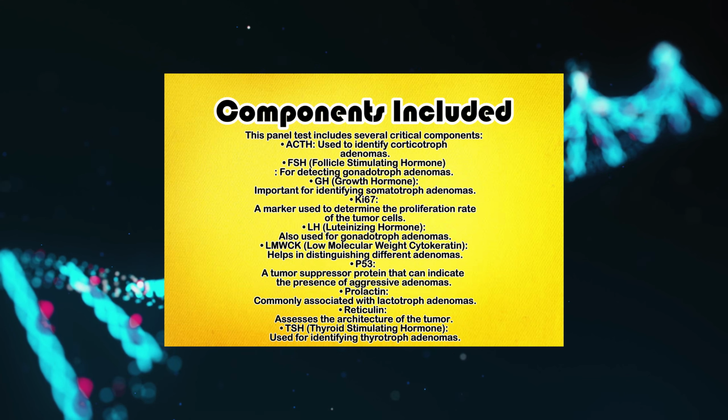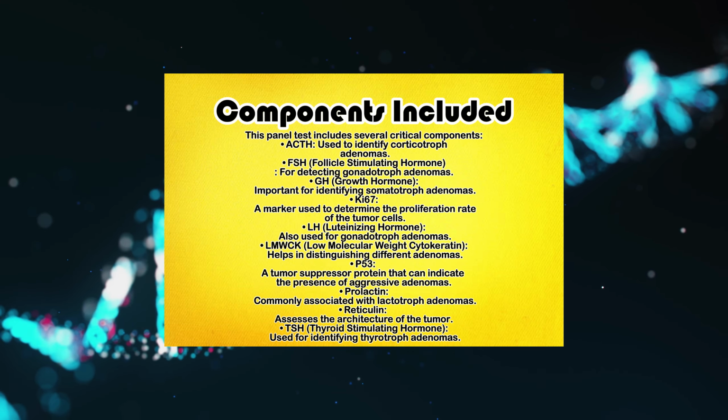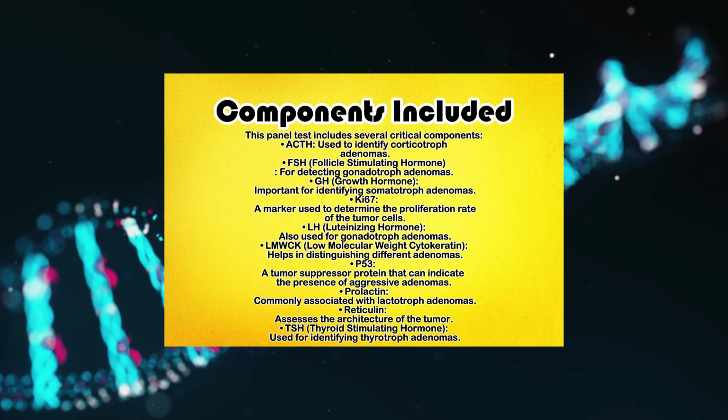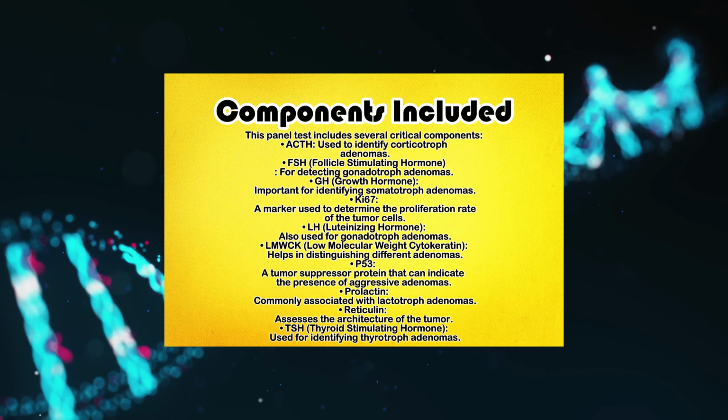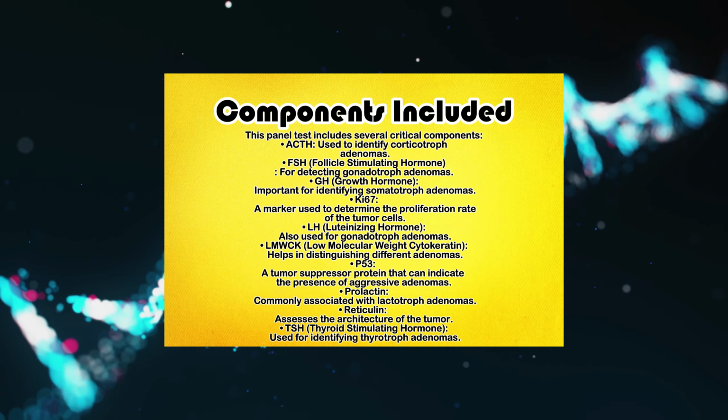Prolactin, commonly associated with lactotroph adenomas. Reticulin, assesses the architecture of the tumor. TSH, thyroid-stimulating hormone, used for identifying thyrotroph adenomas.